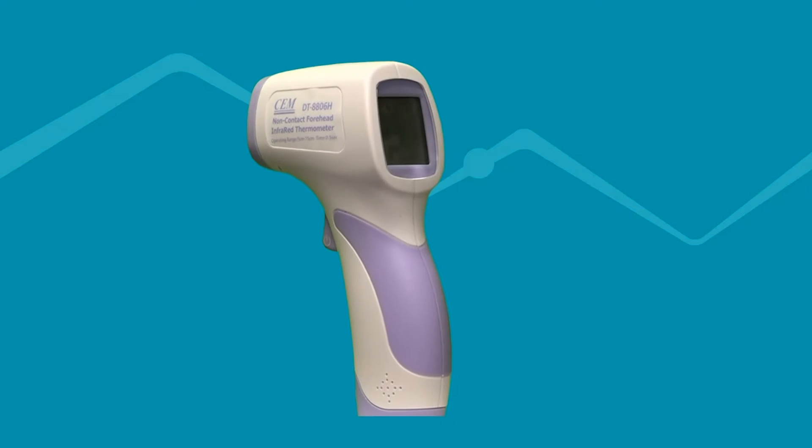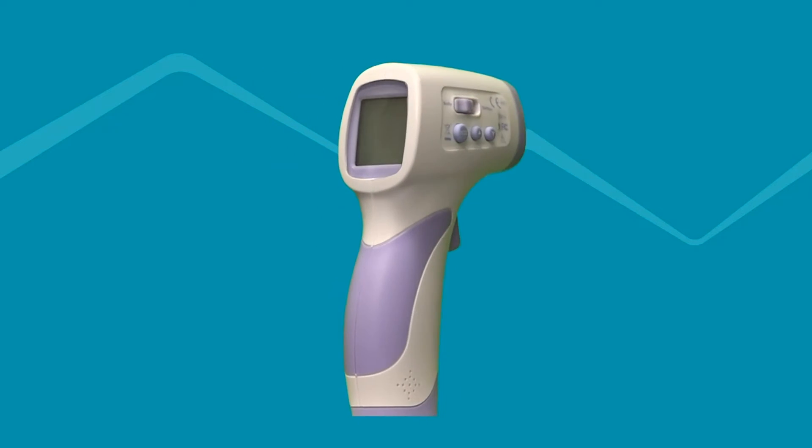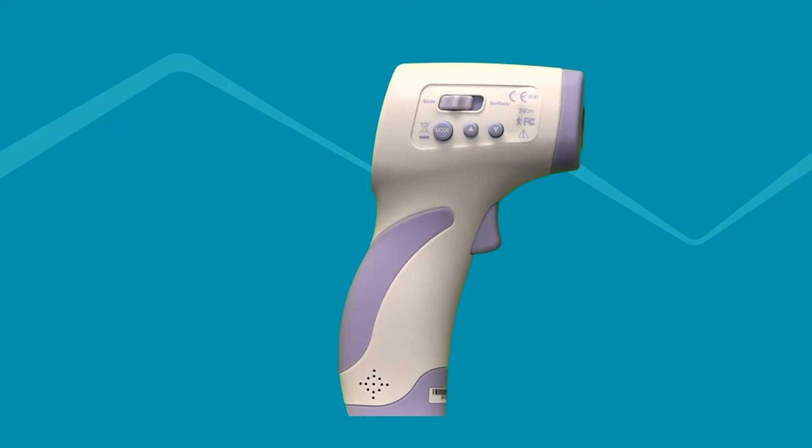It is designed for body temperature measurements for infants and adults without contact to the human body. It can also be used to measure surface temperature of objects or environments using the surface temperature mode.